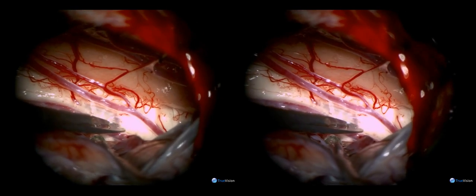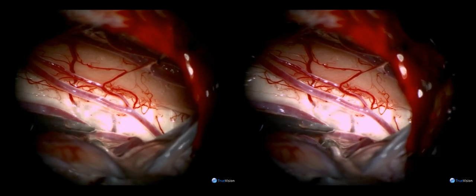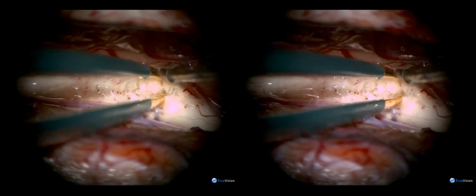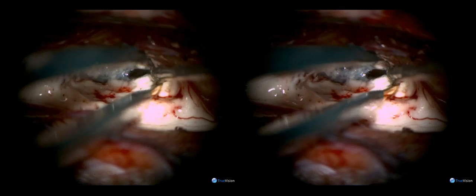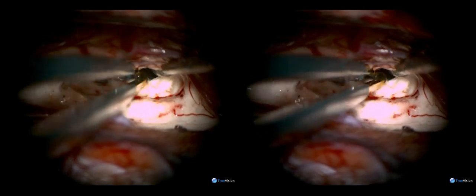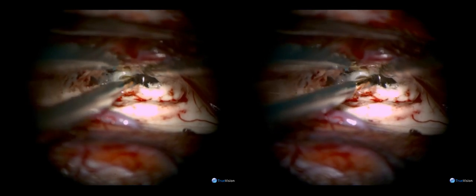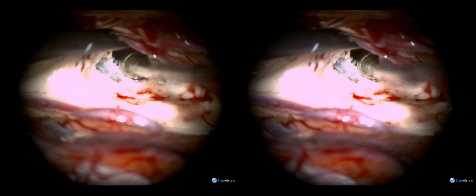Now the corpus callosum is cauterized and divided. The bipolar is used to spread the fibers of the corpus callosum all the way down to the ependyma of the lateral ventricle. The ependyma is then cauterized and entered, and we gain access to the lateral ventricle on the left side.